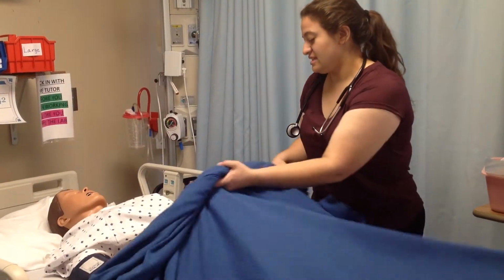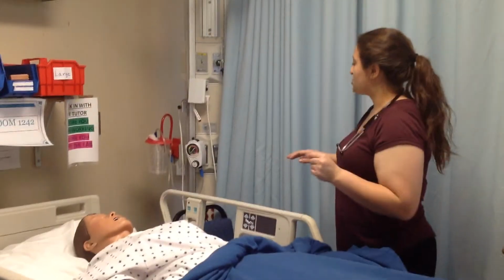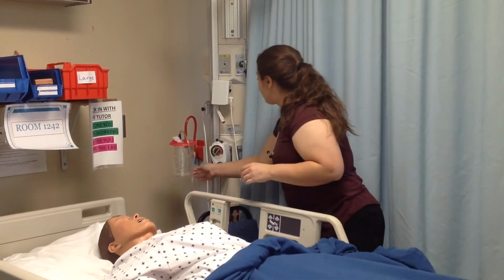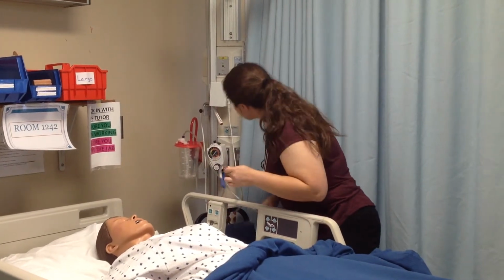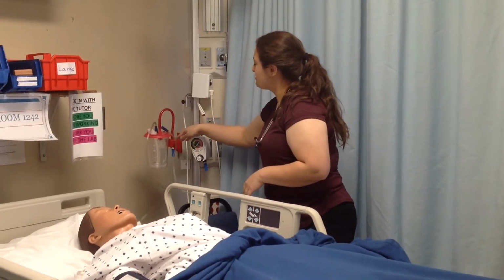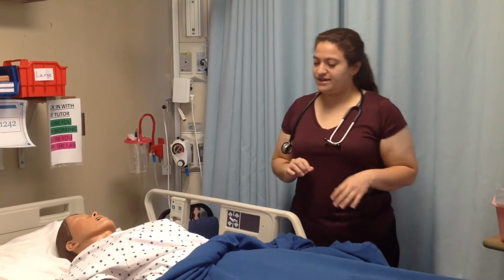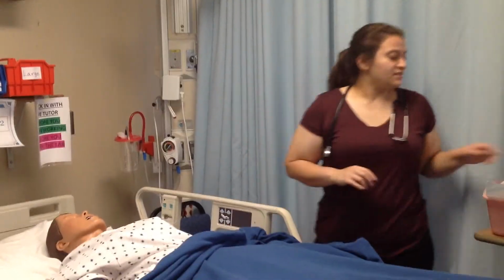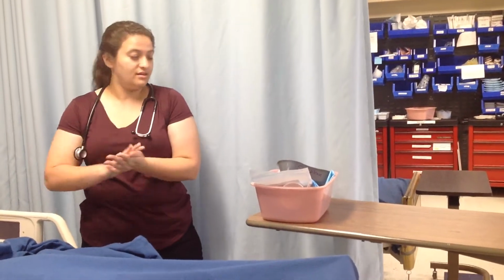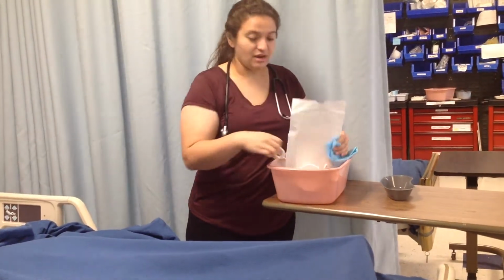So now that I've inspected and auscultated the abdomen, I would make sure that my equipment is working well. So I might just look at these wires to make sure everything's connected well, nothing is abnormal before doing my procedure. So now that I've inspected the equipment, I would start my procedure. First things first, I want to perform hand hygiene. And then I would first grab my tape.